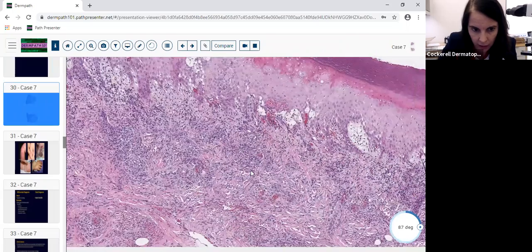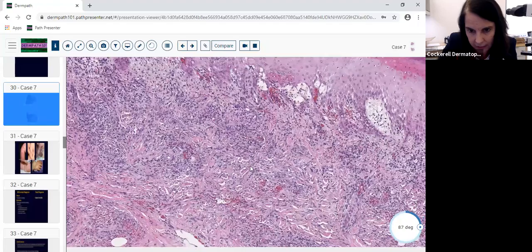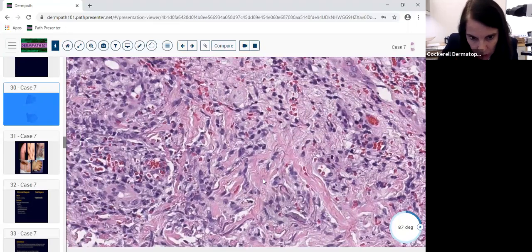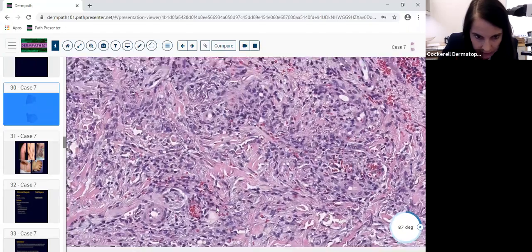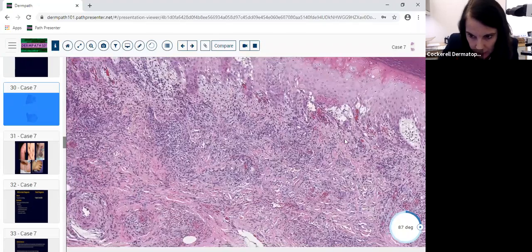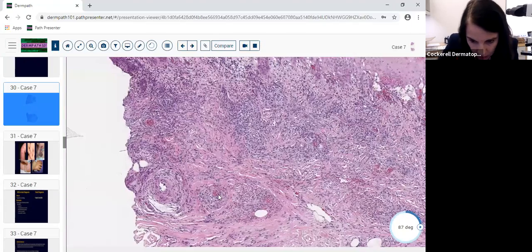We're also noting a lymphohistiocytic population and scattered nuclear dust. We're seeing some neutrophils in here, not many, but this other striking feature is the hemorrhage. We're seeing hemorrhage, and that's making us think about a vasculitis. With all of this hemorrhage, and this is not procedural, you have hemorrhage up here, you also have hemorrhage over here by this vessel, and hemorrhage here.